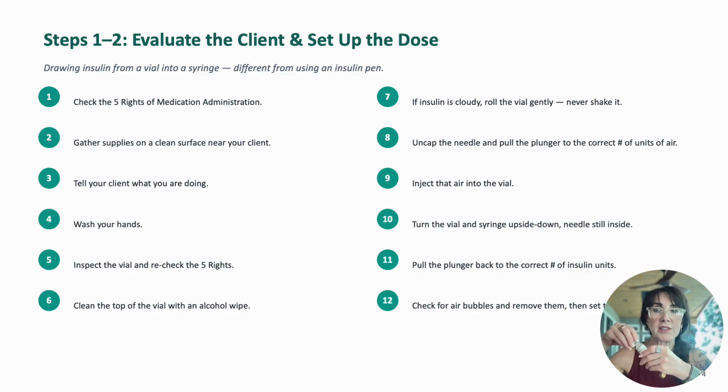For the purposes of this demonstration, I simply have normal saline, but what you're going to do is look at the vial. The product inside should have the appearance that you would expect. So whether it's a clear insulin or a cloudy insulin, it should not have any particulate matter and it shouldn't be an off color. You're also going to check the expiration date, and if it was open previously, generally speaking, we don't keep insulin open for more than 28 days before we replace the vial.